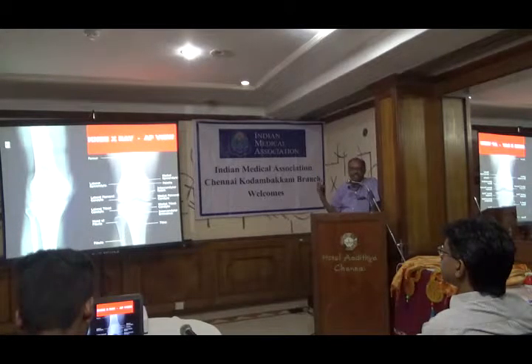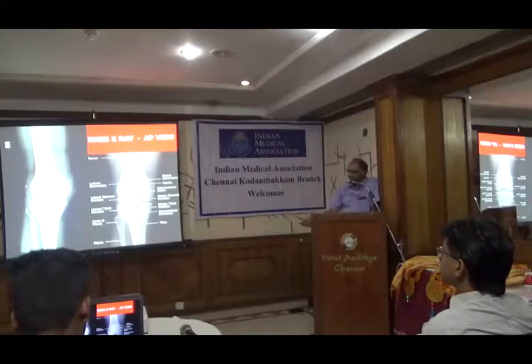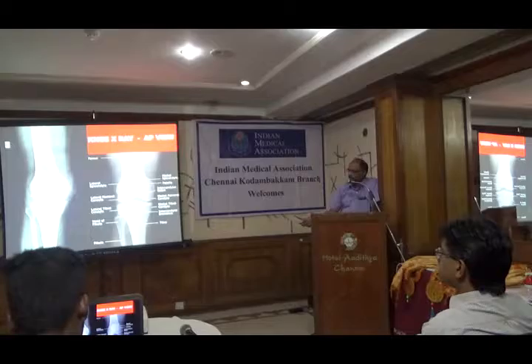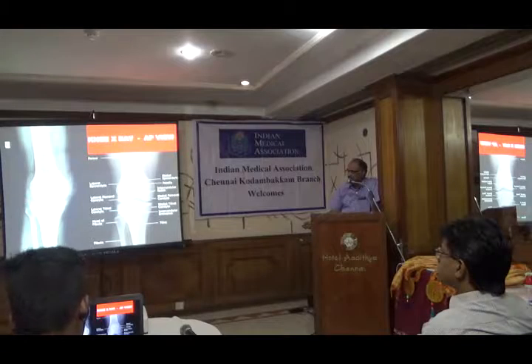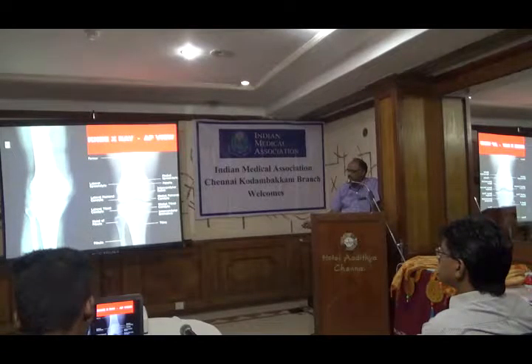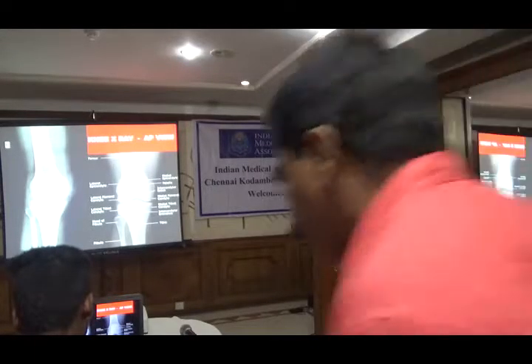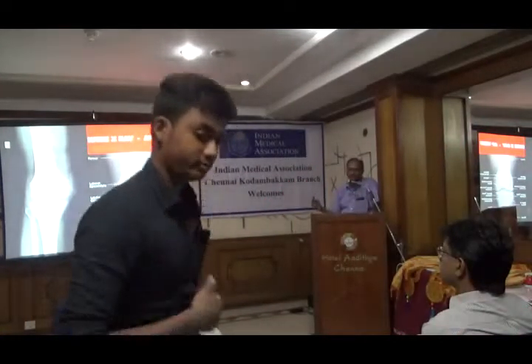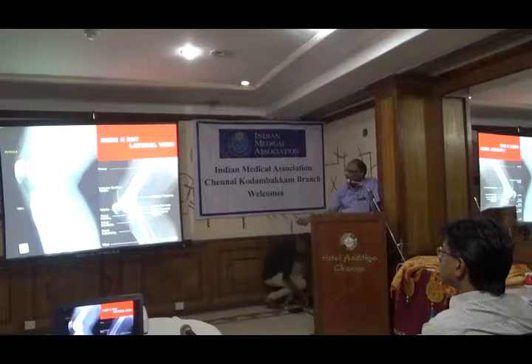Now the digital X-rays have come. In olden days when I was a student we used to take X-rays, but now with digital X-rays the clarity has improved a lot. You can see the soft tissues, lower end of the femur, the contour of the lateral condyle, medial condyle, the superimposed patella, the joint space — lateral and medial joint space — the tibial spine, upper end of the fibula, upper end of the tibia, and the intercondylar notch.